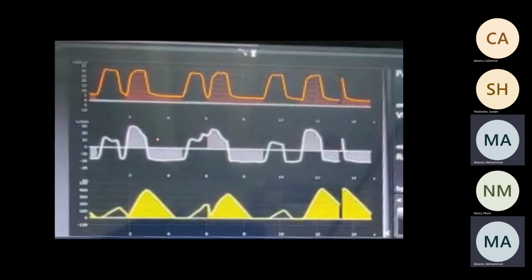You cannot differentiate between, if this was normal, straight and cut down, and then like this. So I know the inspiratory flow did not go back to the baseline without any activity. So this is resistance.